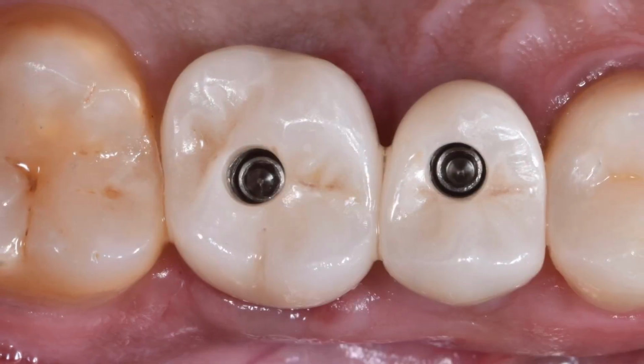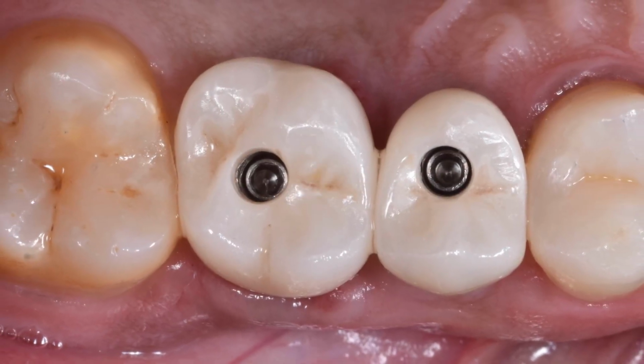I have had some UCLA type of abutments separate because they were not bonded well in the lab, and it just creates a real problem later, because you have to rebond it chairside, which takes time, and you have to have the right material, and you have to use an ideal technique for that. So I like to use a customized abutment and a crown. I have the lab bond this together and create an access hole so that I can then screw-retain this cemented crown on that custom abutment.